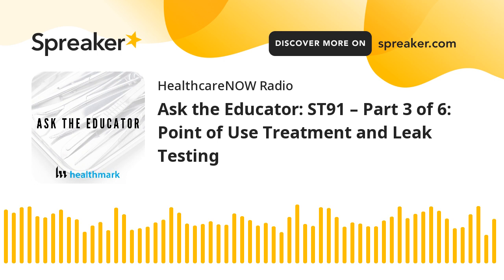Yeah, and being that this is my first time talking about ST91 on these podcasts, I just want to reinforce that this is not an update to a previous document, but rather it's a completely new document. So what people need to have in their possession moving forward and reference is the 2021 version of AAMI ST91. So when it comes to point of use at the bedside, one of the biggest changes is we introduced the term point of use treatment.